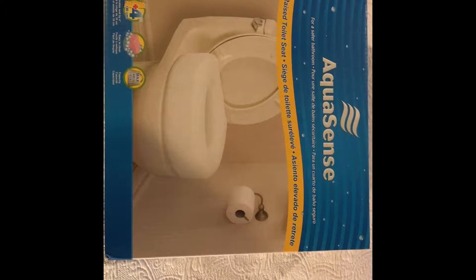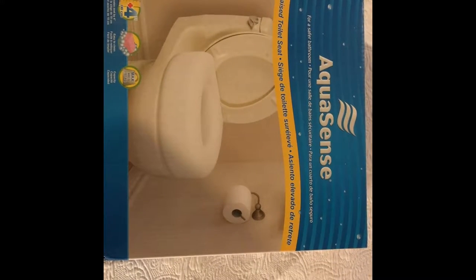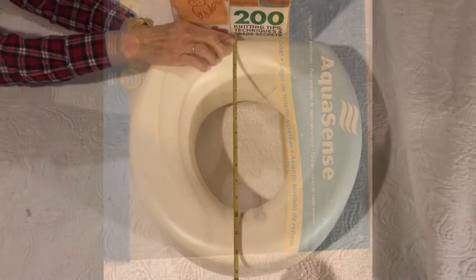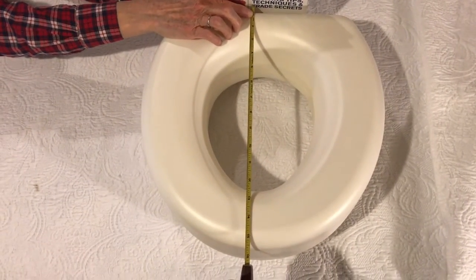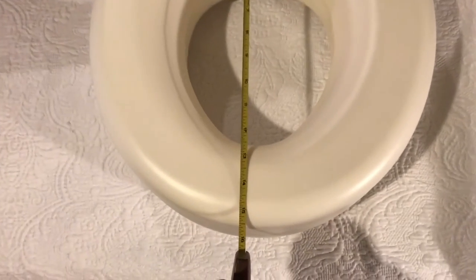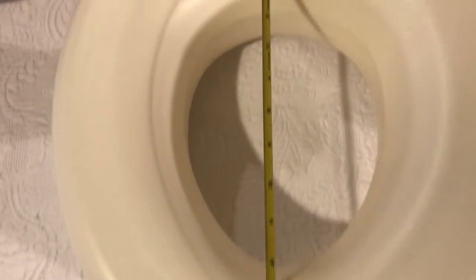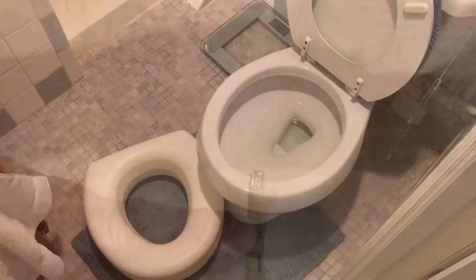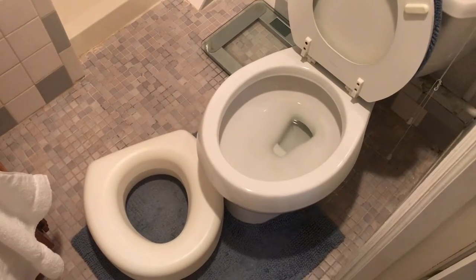I'm going to take a look today and do a short product review of the Aquasense raised toilet seat. We took a couple of measurements here. From the front it's about 15 and a half inches all the way to the back where it juts out a little bit in the rear. The opening of this toilet is 13 inches.